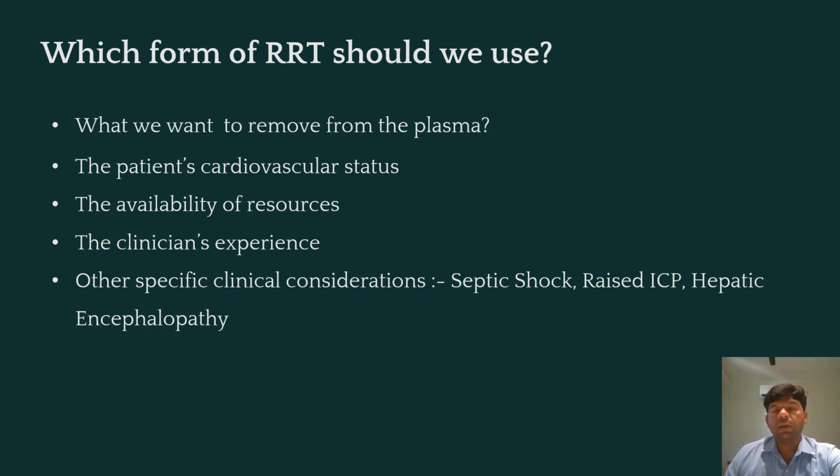and hepatic encephalopathy. In these conditions, continuous veno-venous hemodiafiltration will be helpful. If we compare the data, SLED versus CRRT, a lot of studies have been done, and there is no outcome benefit of the CRRT over the SLED, but definitely whenever the patient has signs of raised ICP, or is on very high vasopressor support, in those conditions it is better to go for the CRRT. In all other conditions you can think about the SLED.